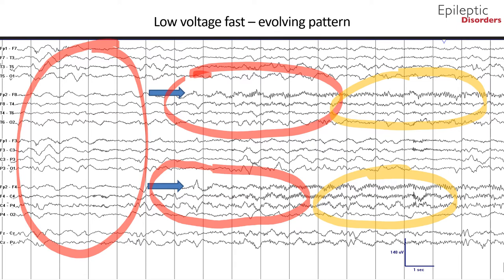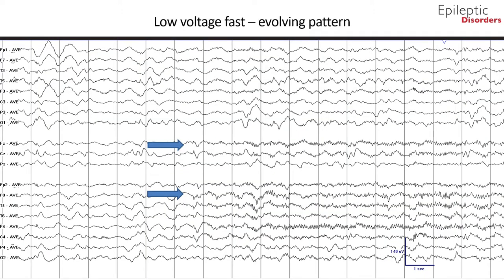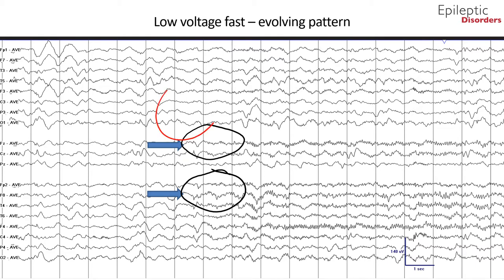We will now look at the same EEG in average montage. Over the right frontal regions in the F8, FP2, and frontal midline channels, there is an initial sharply contoured waveform followed by a brief attenuation with buildup of low-voltage fast frequency activity that becomes more apparent towards the end of the page.